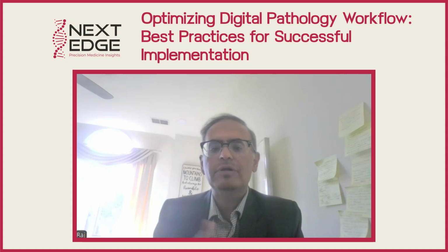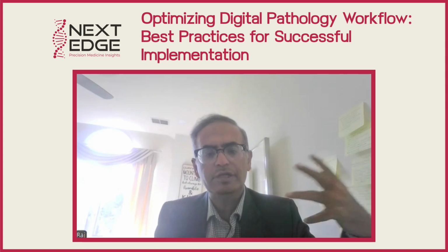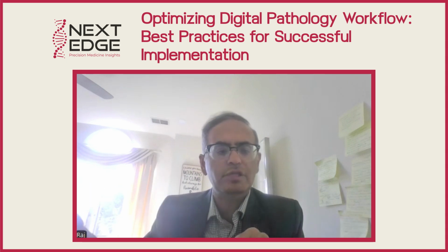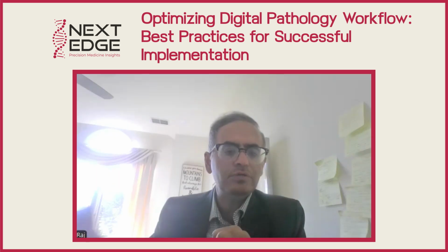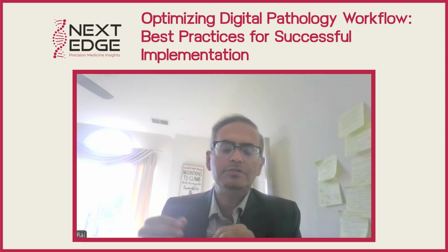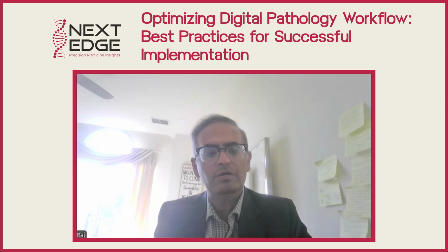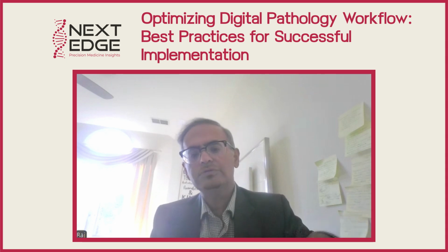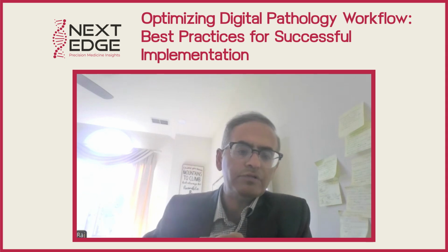So there are AI modules now being created that can actually look at a digital slide of even an H&E image. They're not even doing the stain, but can now predict from the H&E image whether the patient has a low HER2/neu. So the pharma companies are also now becoming very interested in all this because now they can use digital pathology for predicting the underlying molecular alteration, and also, using multispectral imaging, predict what kind of drug is going to work for this patient.